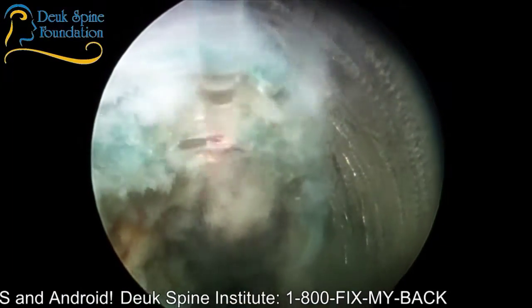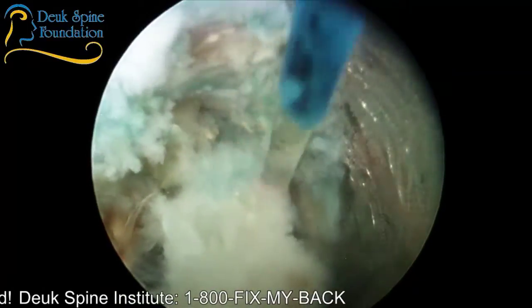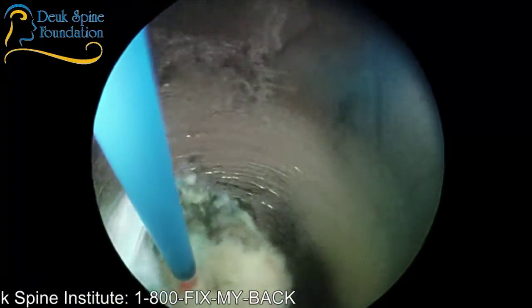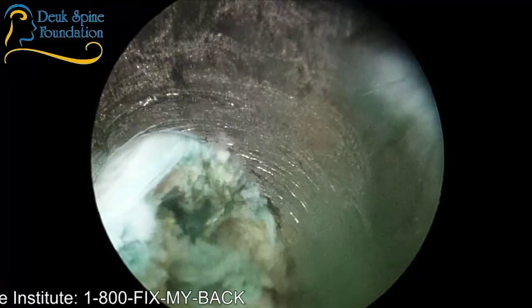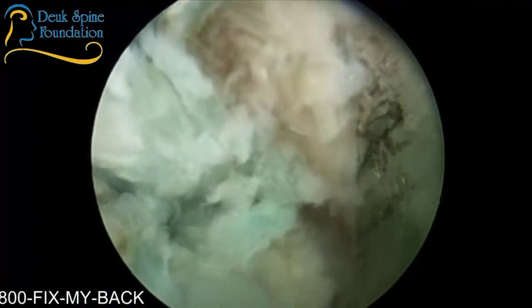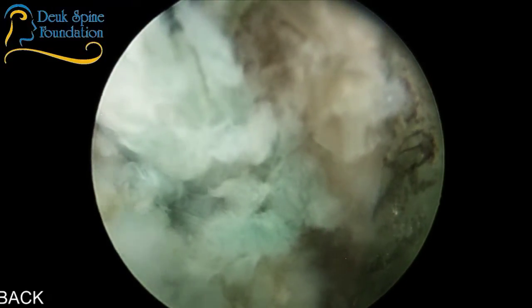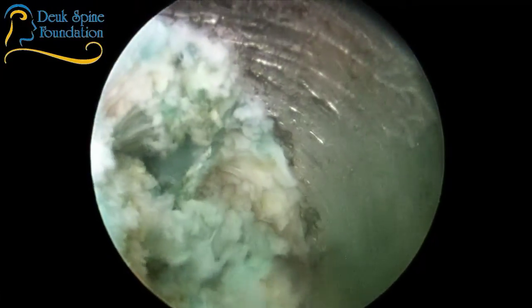look at that herniation right there, folks. That's pretty amazing, isn't it? You see it wiggling out? Standby laser. That is exactly what I'm talking about. A piece of nucleus pulposus wedged into the annular tear, causing inflammation.